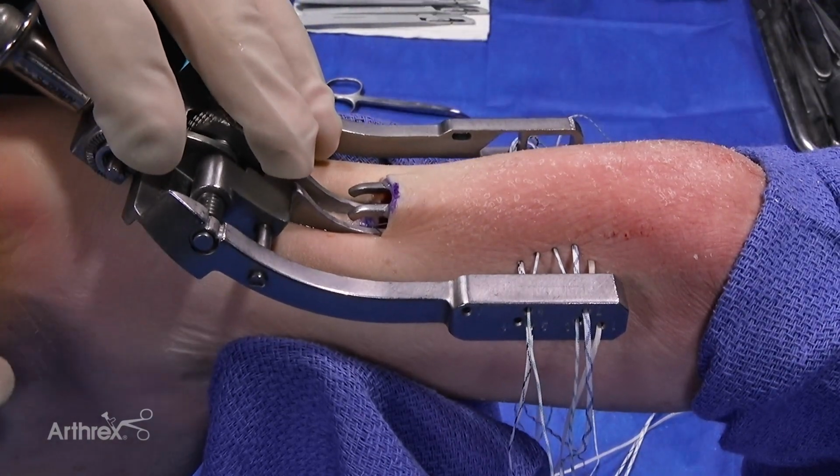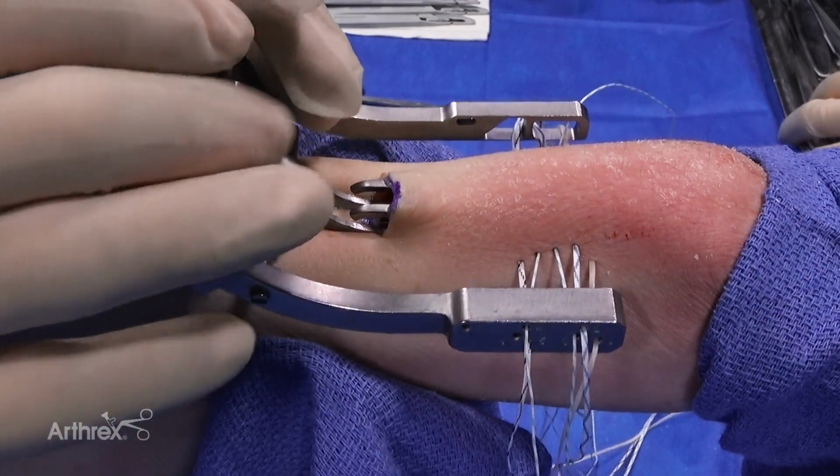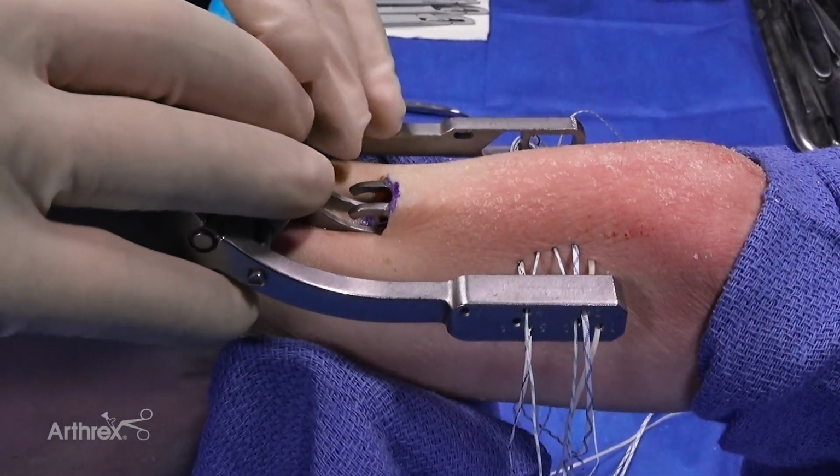I do double lock. All my elite athletes are going to start earlier rehab, perhaps more aggressive rehab, to basically get more security for my sutures.